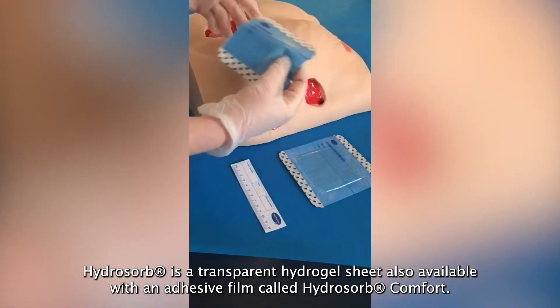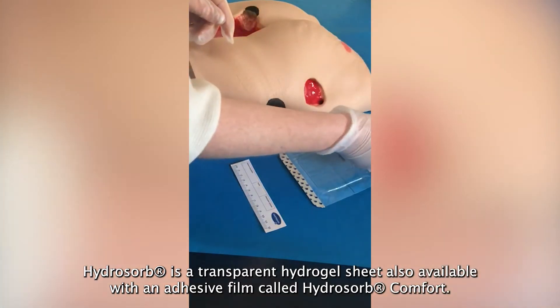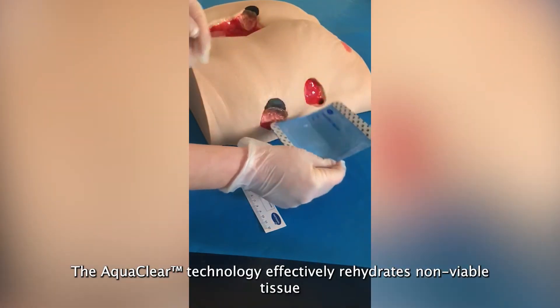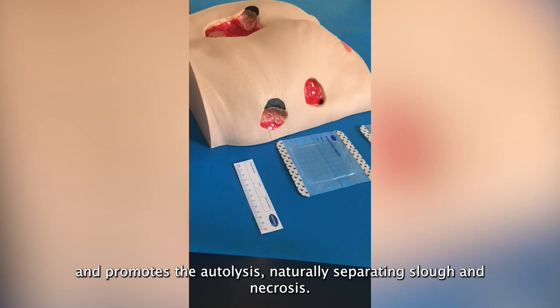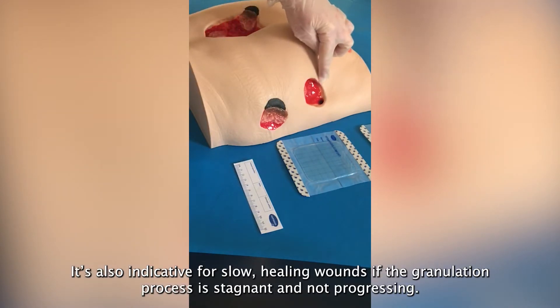HydroSorb is a transparent hydrogel sheet, also available with an adhesive film called HydroSorb Comfort. The AquaClear technology effectively rehydrates non-viable tissue and promotes autolysis, naturally separating slough and necrosis. It's also indicated for slow healing wounds where the granulation process is stagnant and not progressing.